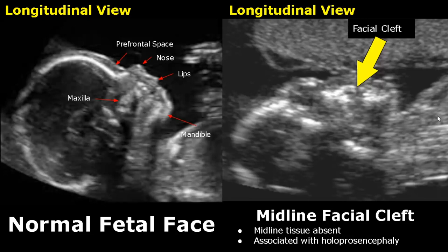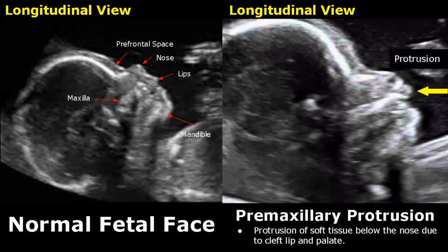3D ultrasound and MRI are much better modalities for such abnormalities. In some cases of cleft lip and palate, there is protrusion of soft tissue below the nose. We can see some protrusion of soft tissue in this longitudinal image — it is called premaxillary protrusion.